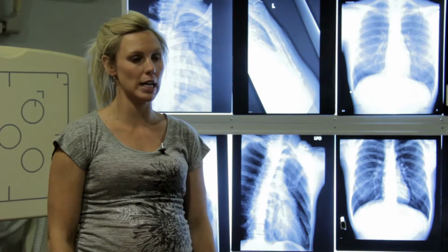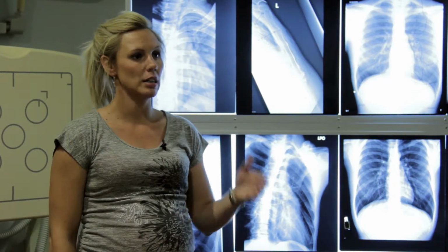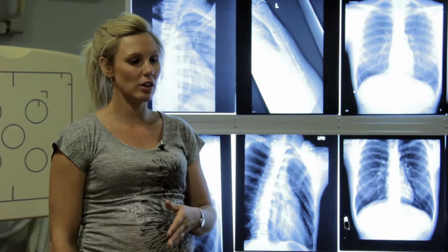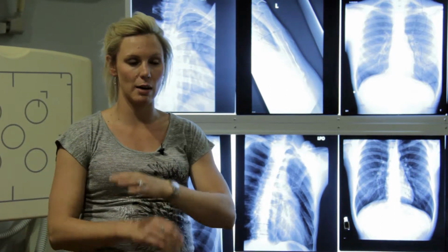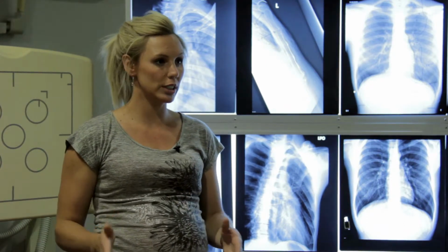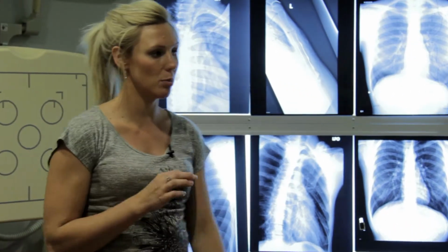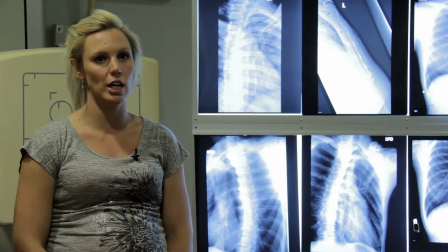AP chest, upright as possible. If you can sit them up in the bed and get that AP chest with the BB, that's your starting point. If they cannot stand, if they cannot sit on a stool, they absolutely can't, you can only get them semi-upright, you will do your full series on the table. If it truly is upper rib pain, that will mean 3 pictures after your chest.